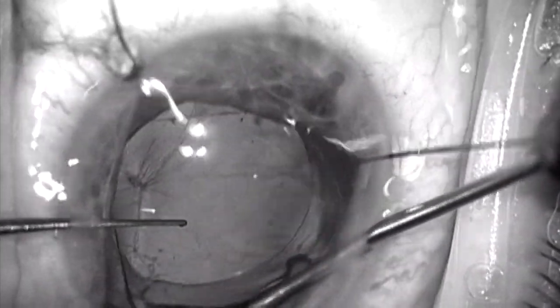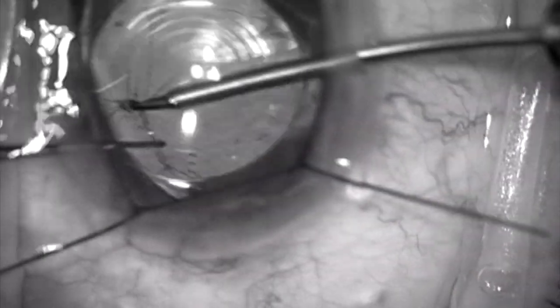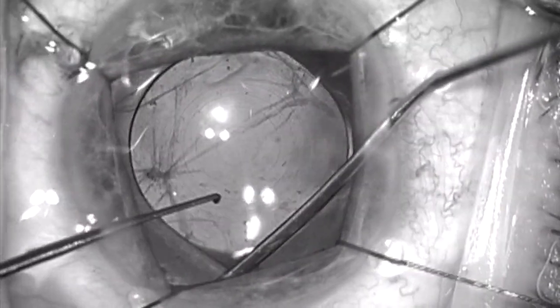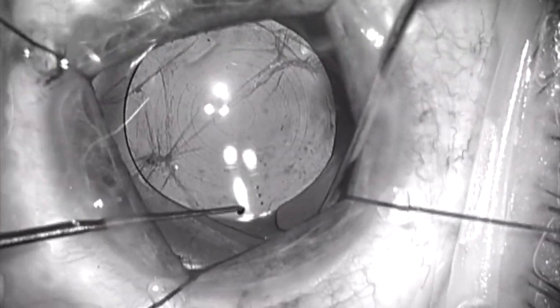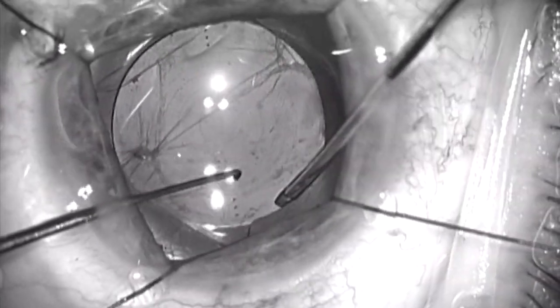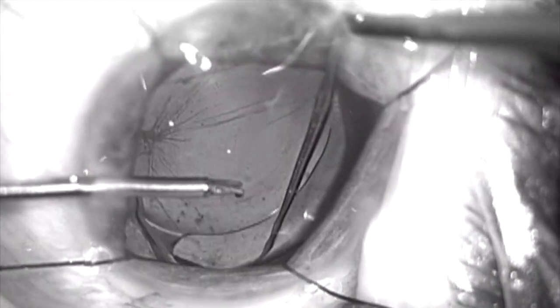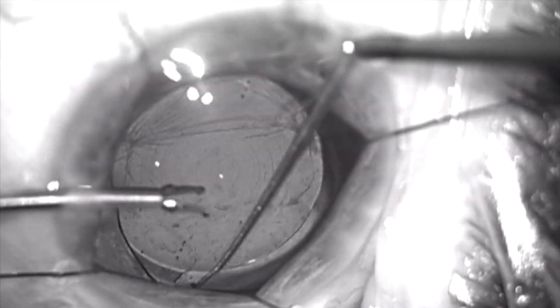You can see me repositioning the haptic-optic junction as much as I can under the anterior capsule rim. But the problem is that I think there may be some fusion of the anterior and posterior capsule far out in the periphery where I cannot see it under my iris retractor. So I feel I'm going to probably need to rotate this lens a little bit to get this haptic completely within the capsular bag fornix. I'm trying to reposition it again, but I feel there is some resistance in the peripheral capsular bag that's preventing me from really seating it properly.